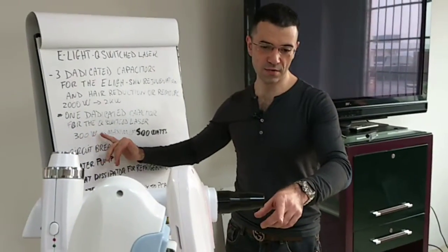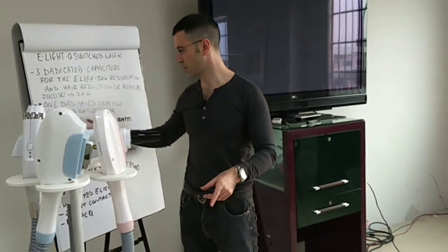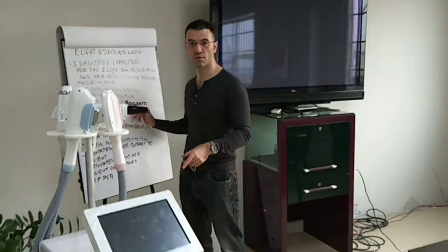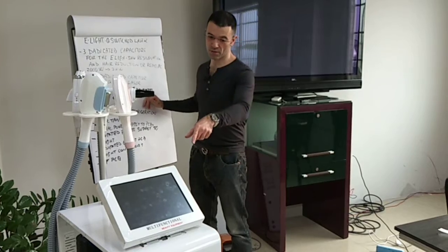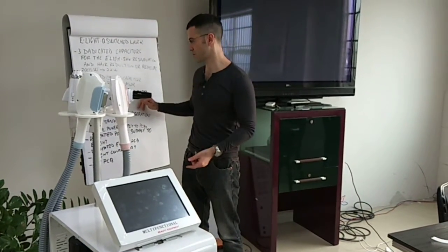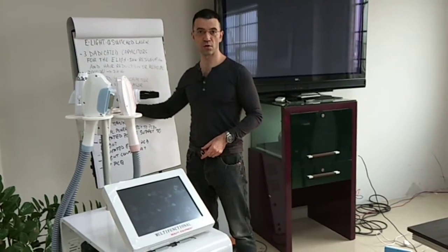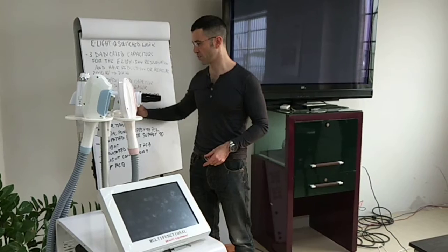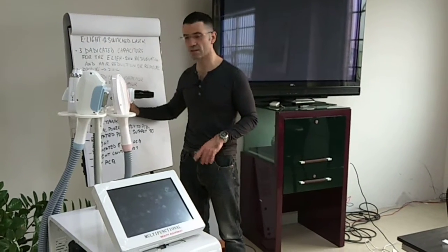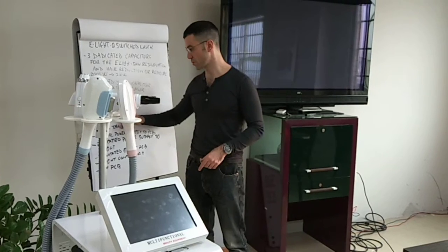We've got, in this version, the 300 watt unit, but we can actually have an option to 500 watt Q-switch laser, which is not in here, but the capacitor is larger, the power supply is larger, and so on. But we're going to show you that in a second. If you watch the CO2 laser part of the series, then we've got a circuit breaker as well at the entrance of the power supply.